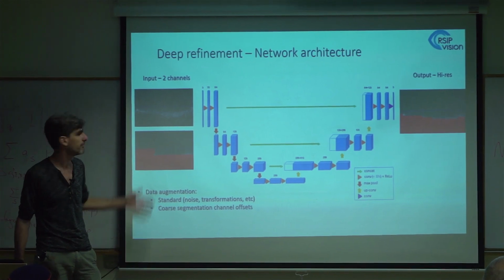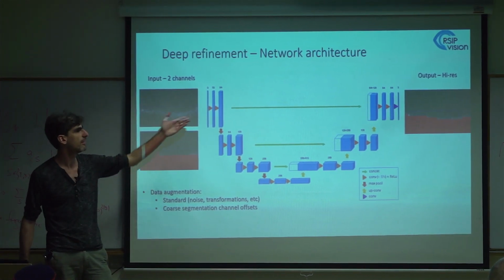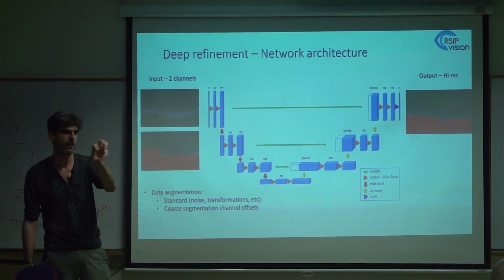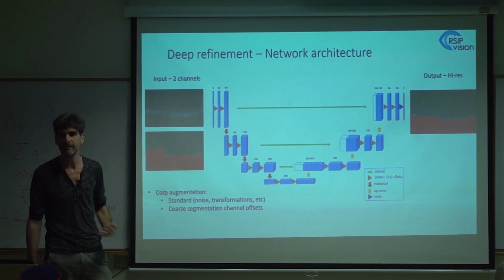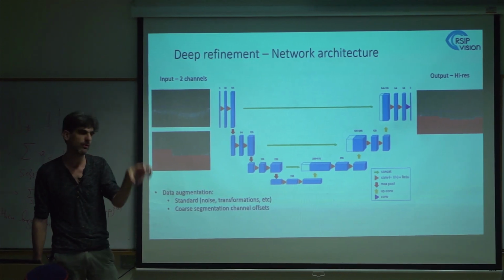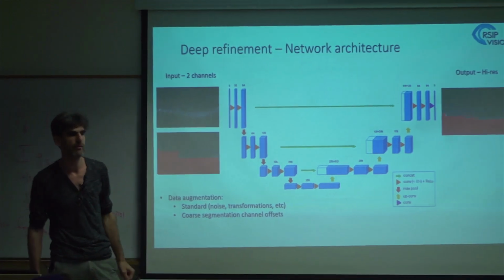And it's the same problem. Basically, now your input is 2 channels. You want output just a high resolution channel, and you're working in patches. But you only have to run this on a relatively small fraction of the volume, because now you know where your bone is and you know where the cortex of the bone is.